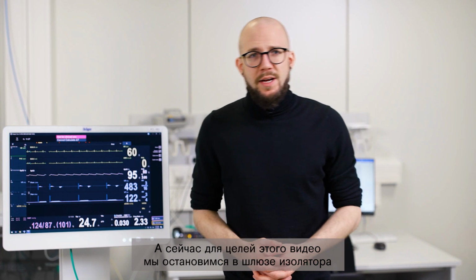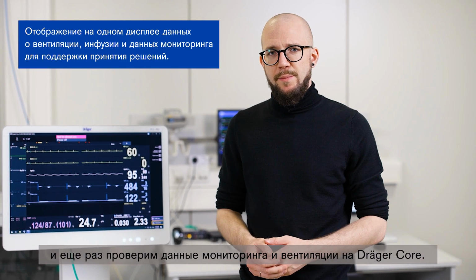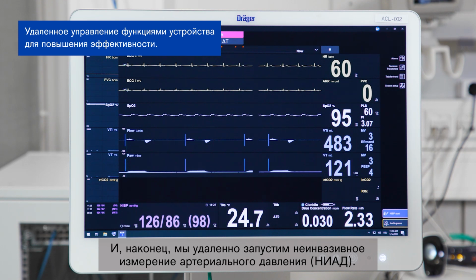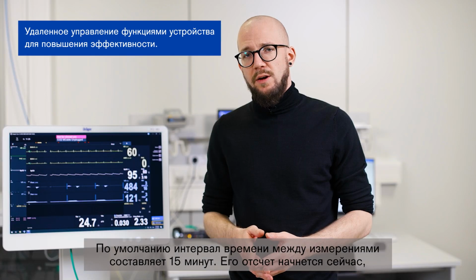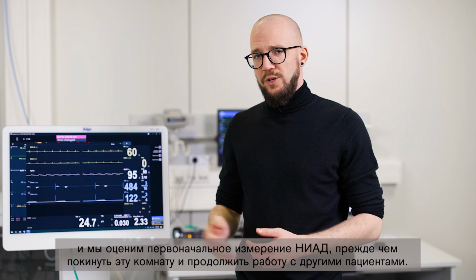We will stay now some time in the anteroom of the patient's room, doing our documentary and check one last time our monitoring and ventilation data on the core. At last, we will start an NIBP measurement. And due to the default time interval on this ward of 15 minutes, the interval will start now, and we will check our initial measurement before we leave this room to check our other patients.